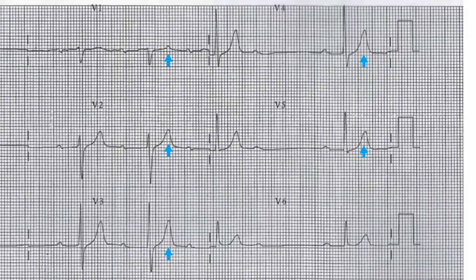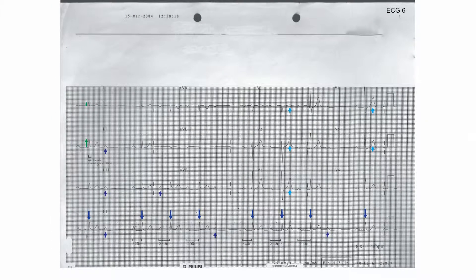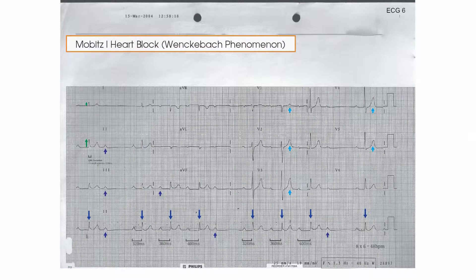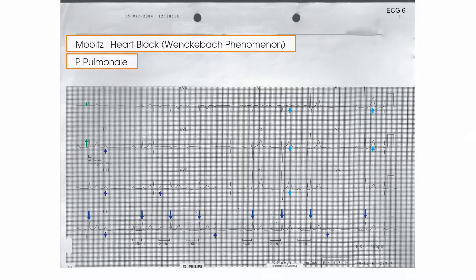In summary, this ECG of a patient with a collapse shows the Wenckebach phenomenon and possible evidence of P pulmonale with peaked T waves anteriorly.